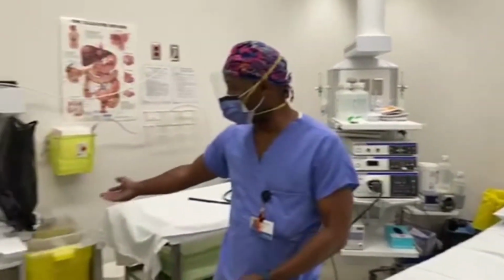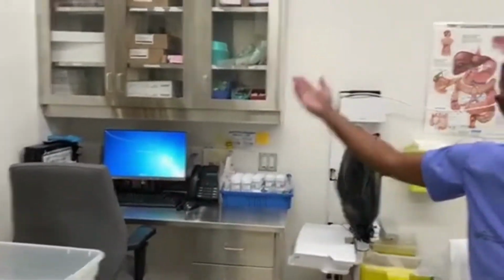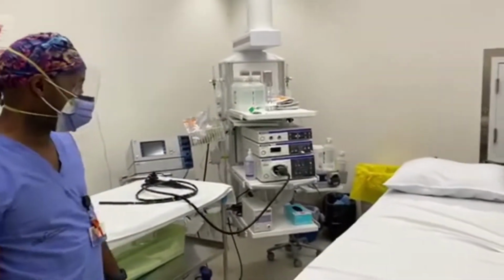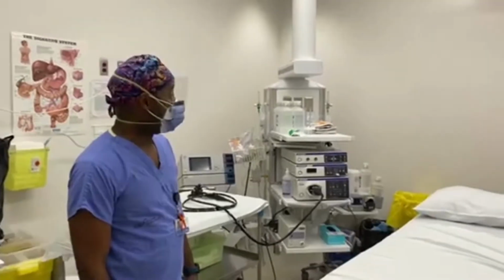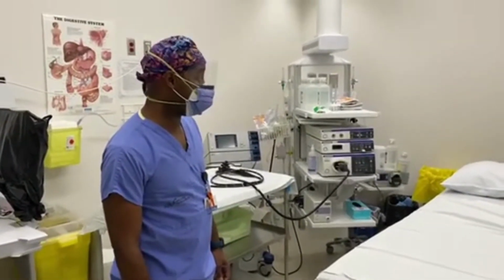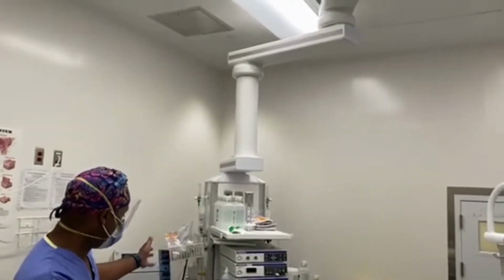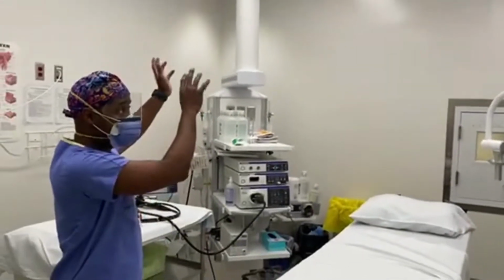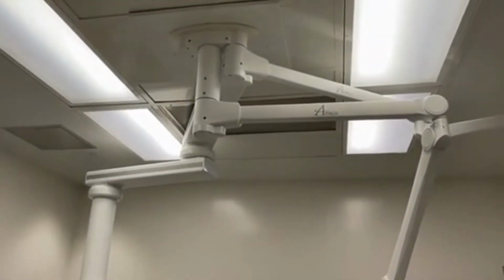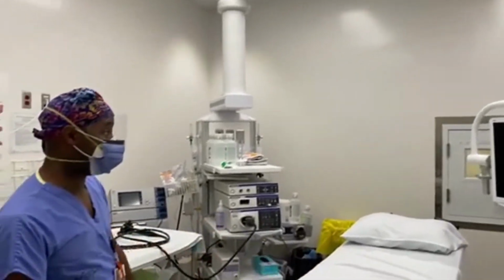And then we've got over here specimen containers, workstation for the physicians, and all of the trappings that we would need to take care of any happenings that come up. The other great thing about this site that they don't have at the other sites, at least not yet, is this really unique boom system. So if you'll notice, everything is actually off of the ground. All the wires are through the boom system here and not on the ground. So much safer and easier to travel around and work around in this space.